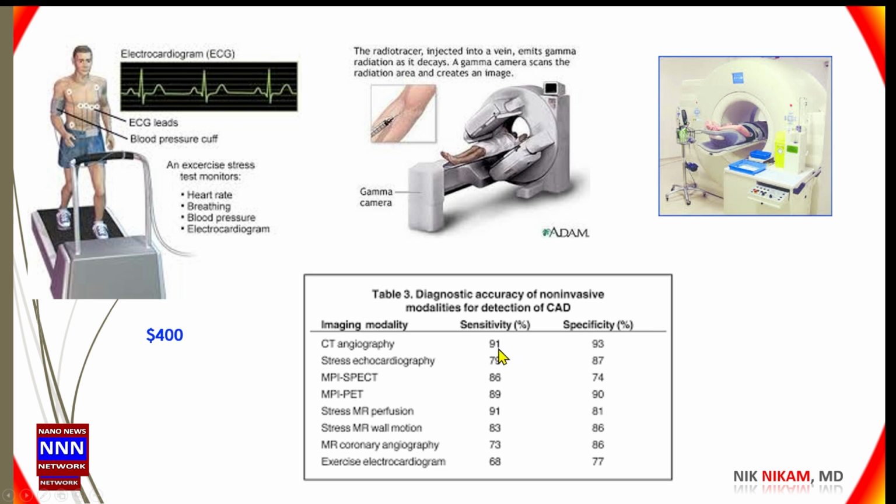But by the same token, CT angiography may not be reliable if there is a lot of calcium overlapping the blockages. But still, it is one of the best ones that can be done. Nuclear PET scan comes next to that.